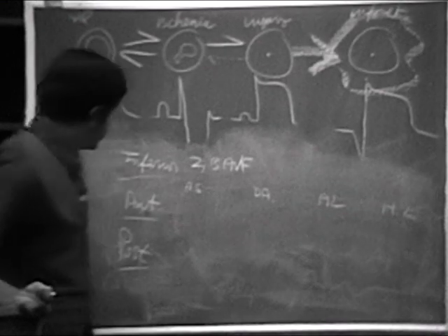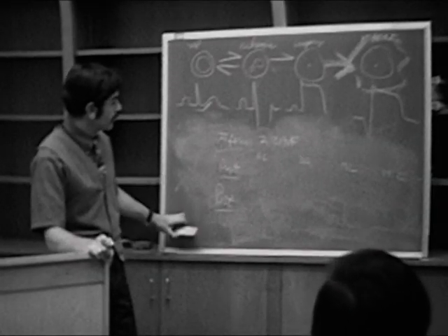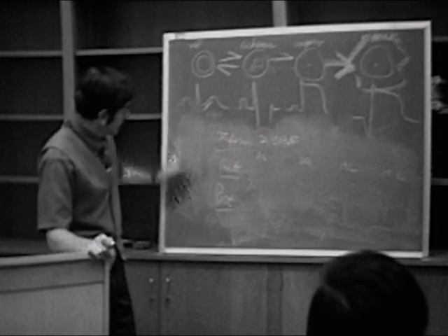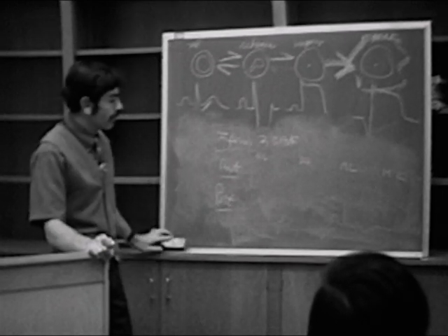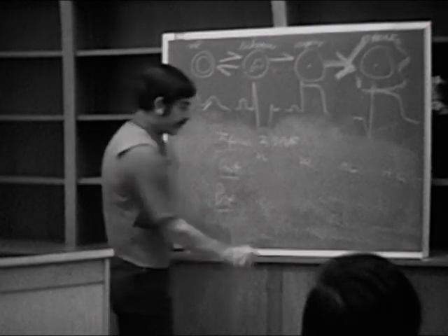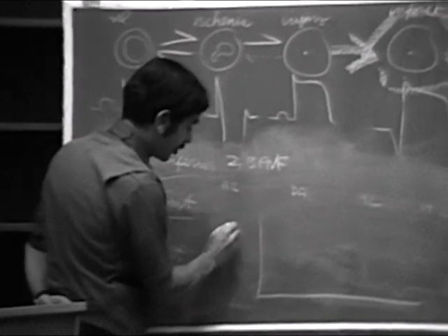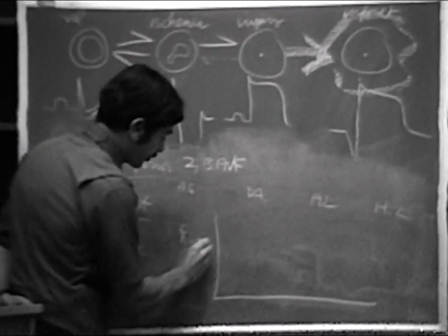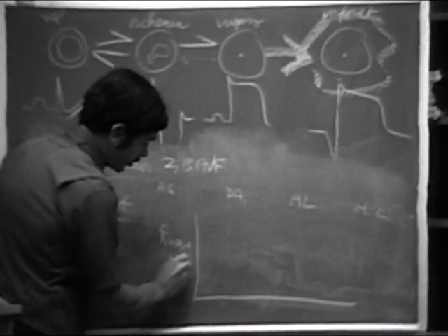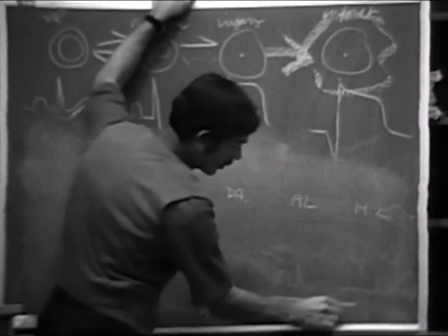All right, now, talking about the anterior wall. If you recall, we made a diagram a while ago in our first lecture here. It looks something like this. And we talked about R wave height, and we plotted that against the lead, V1 through V6.